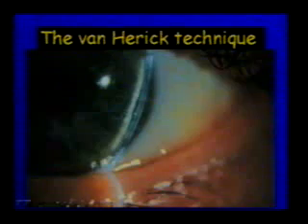On the other hand, if the anterior chamber distance here is very shallow, the angle is quite narrow. So we will notice the depth of the AC compared to that of the cornea. In this example, the AC is equal to, or larger than, that of the cornea, so the angle is estimated to be between 35 and 45 degrees.